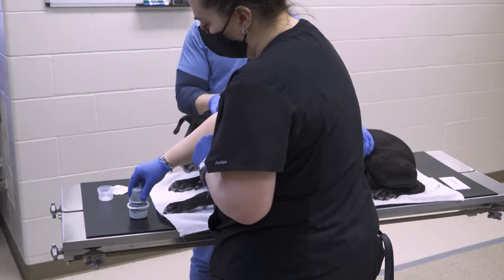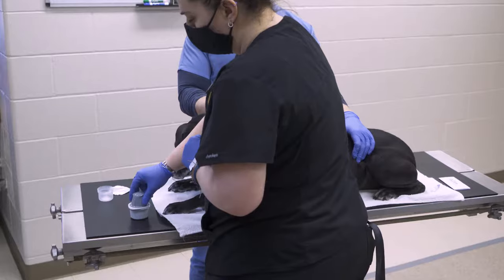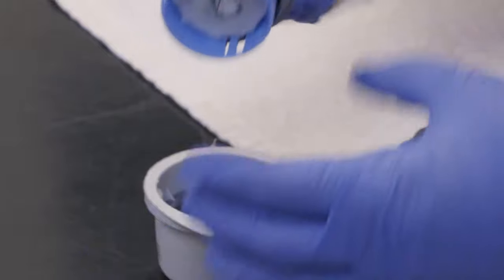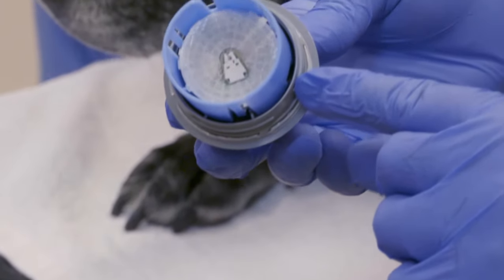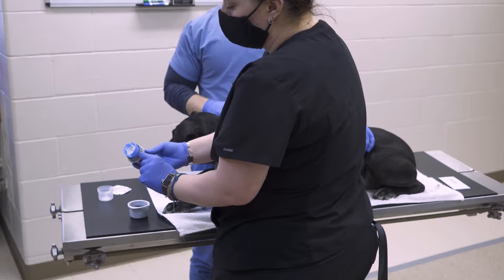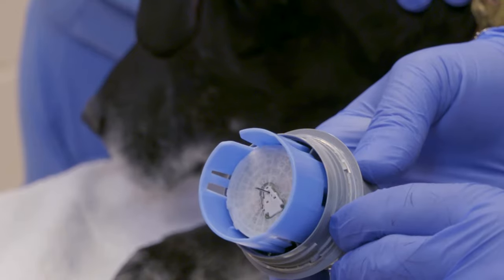Place on a hard surface and push down firmly on the applicator until it comes to a complete stop. You will have to push quite firmly. Remove the loaded applicator from the sensor pack and turn it over. The needle and underside of the sensor disc are visible in the applicator. The needle contains a 5 millimeter filament.